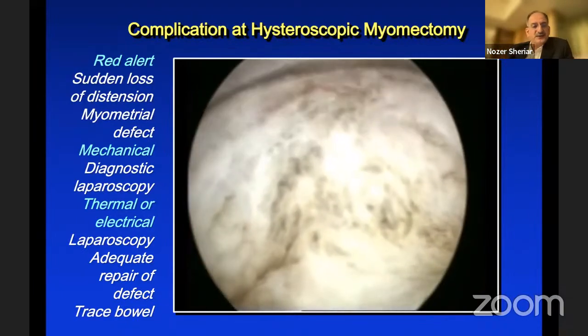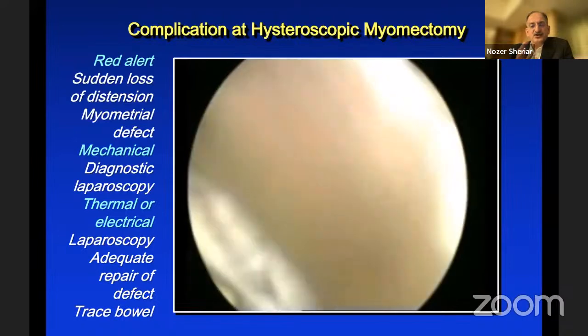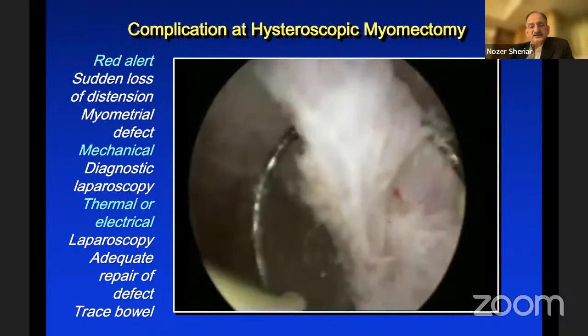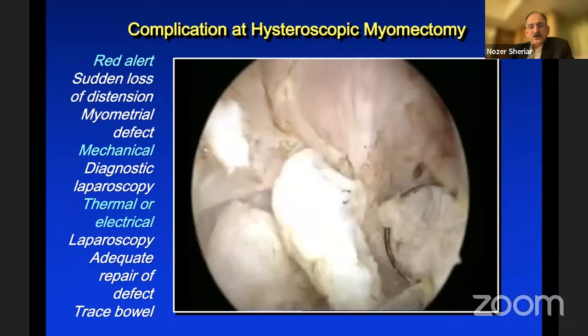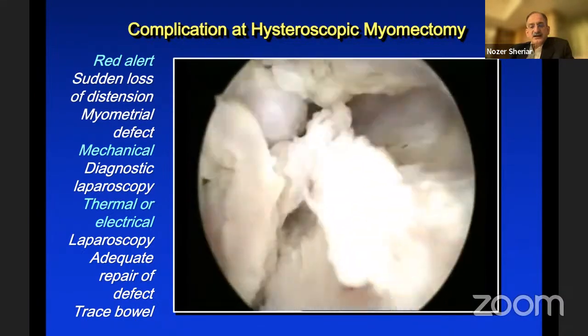Look at that myoma popping in. And this went on and it was going really well. There's that myoma in front. You can see the capsule. I'm also doing a TCRE for her. Obviously, there's going to be an element of adenomyosis, all going extremely well. And this was the TCRE part. Myomas coming in.